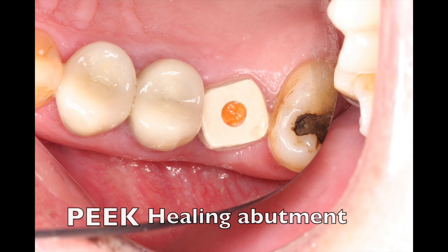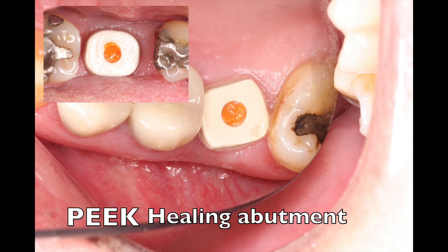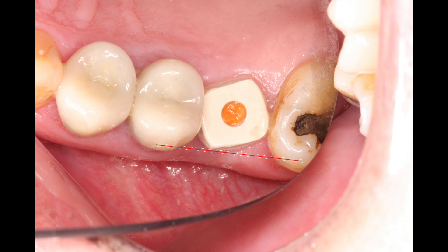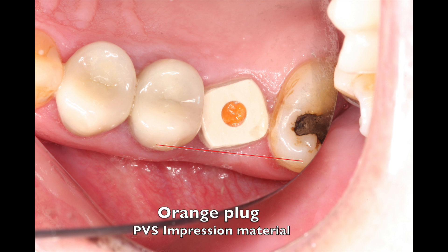You'll notice that on this connection I was able to put on a PEEK healing abutment, and normally these are supposed to line up with the facial surface. You have to have the hex inside of the implant line up with the outer wall to line up with the arch, and so I was a little bit off here — this is the first one I placed.